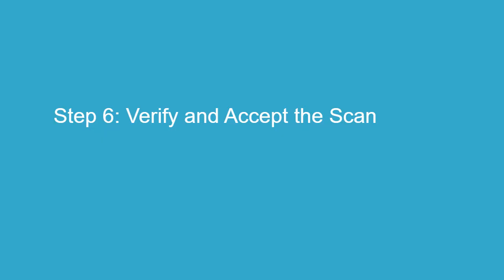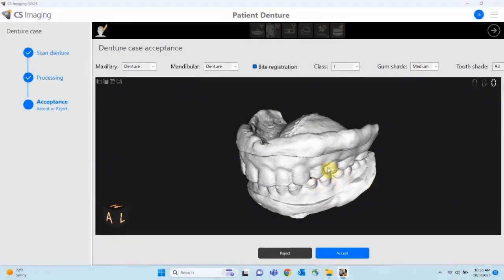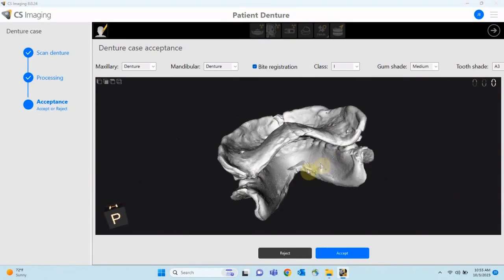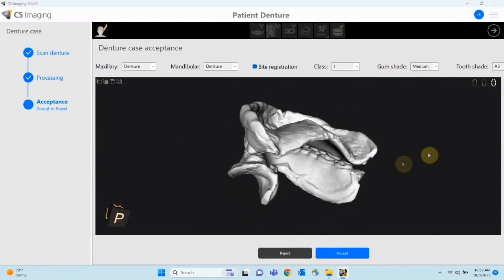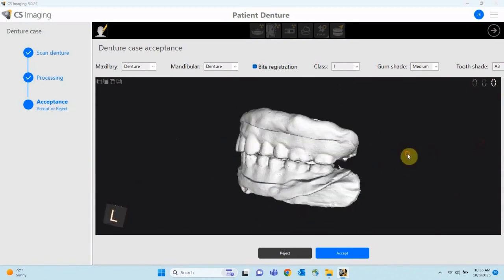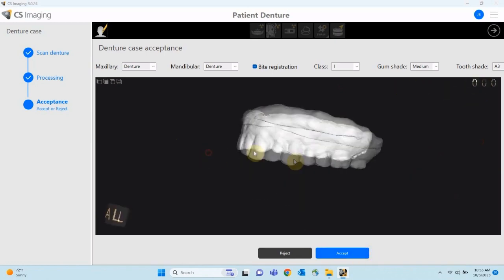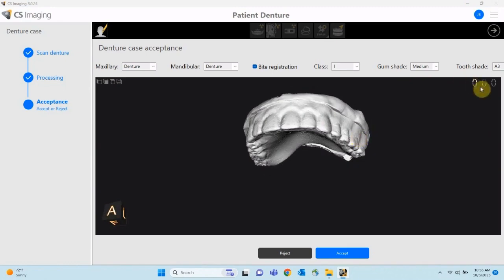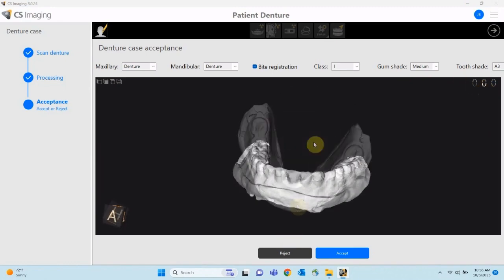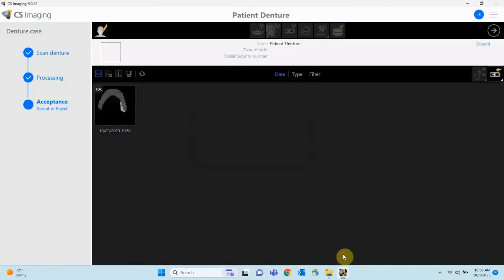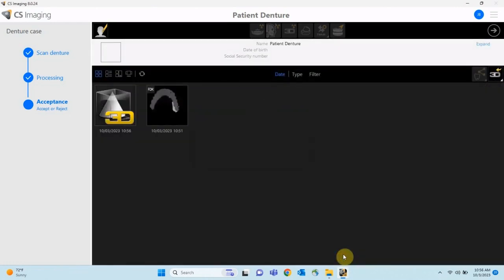Step 6: Verify and Accept the Scan. The final step is to ensure the accuracy of the scan. Inspect the 3D image for accuracy and check both arches individually and in occlusion. Accept the scan, saving 1, 2, or 3 STL files, or reject the scan, creating no files.